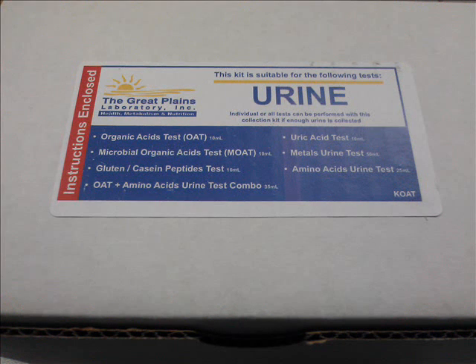First, let's review the contents of the test kit. All materials that you will need will be contained in this small box. The label shows which tests can be performed with this kit. We can perform the organic acid test, microbial organic acid test, gluten casein peptide test, uric acid test, metals urine test, and amino acid test with a sample from this kit.